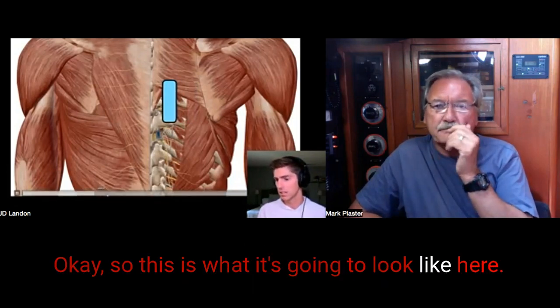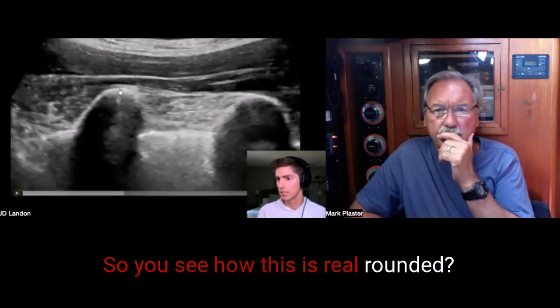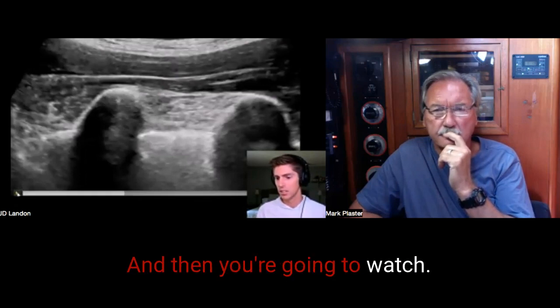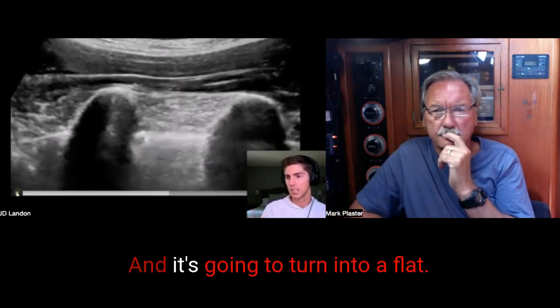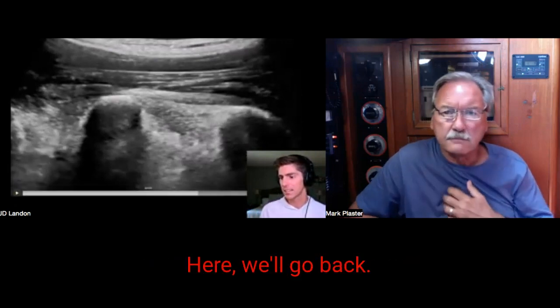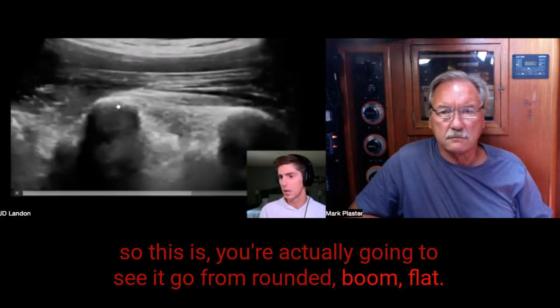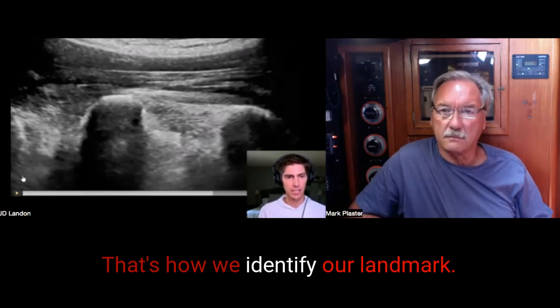Okay, so this is what it's going to look like here. I'm going to stop it. You see how this is really rounded? That's your rib. Here is going to be our pleural line, and then you're going to watch it slide medial and turn flat. Did you see how this turned flat? We'll go back to where the tip of the rib is. You're going to see it go from rounded, boom, flat. That's the transverse process. That's how we identify our landmark.